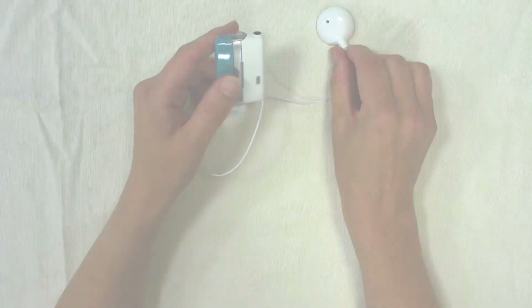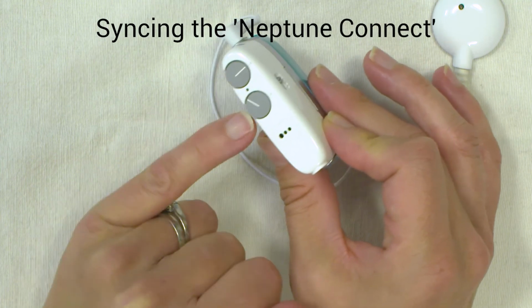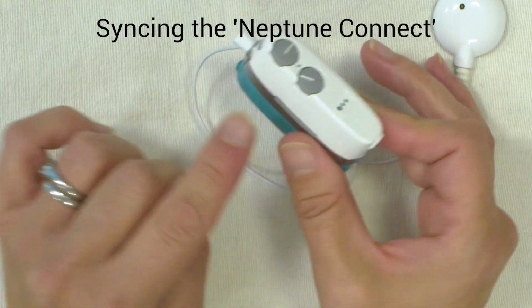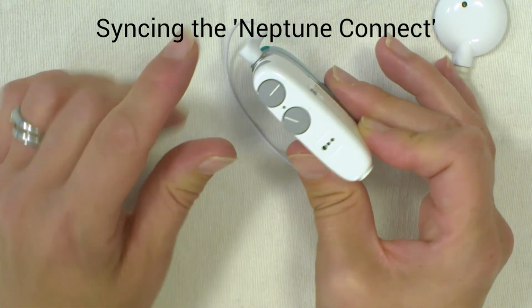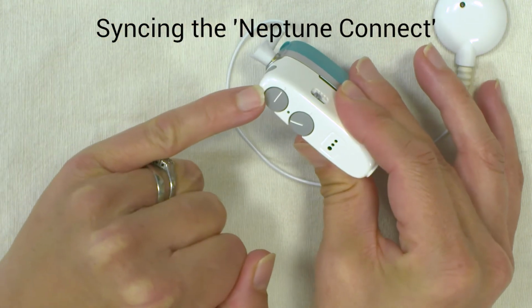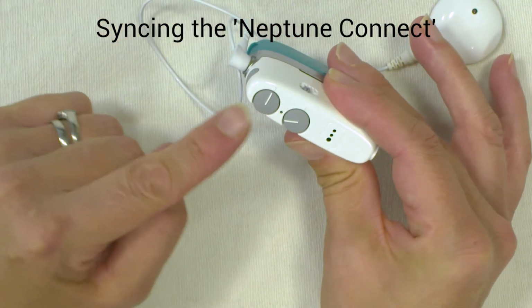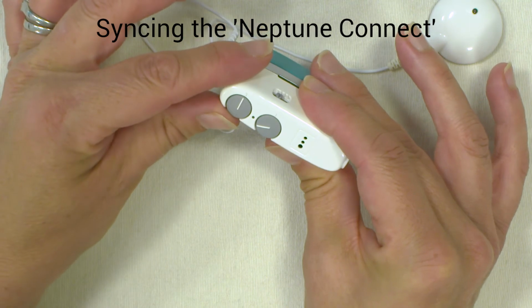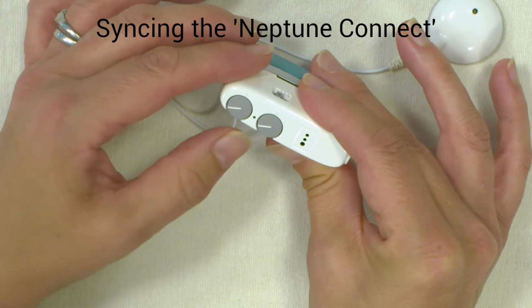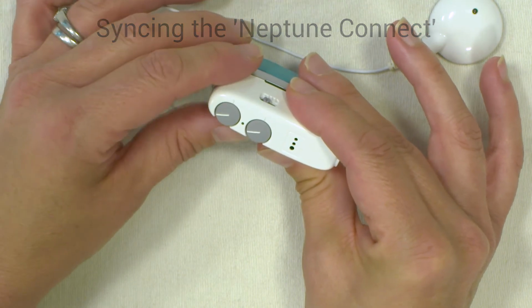If you notice a flashing red light on the connect between the volume and sensitivity control, it means that the connect isn't synchronized with the processor. In order to resync it, you need to put the volume control, the left hand one as we're looking at it, or the one where the coil lead is plugged in, nearest to that one. If you turn it to 8 o'clock, and the light goes green, you now know it's synced, ready to go.